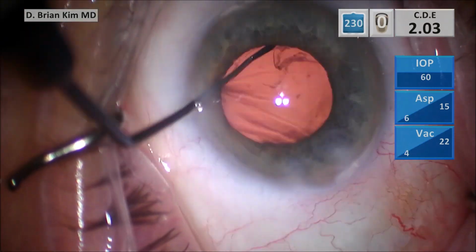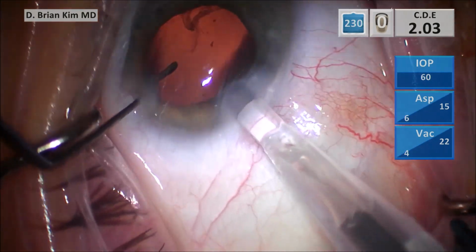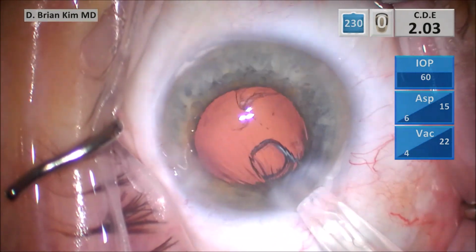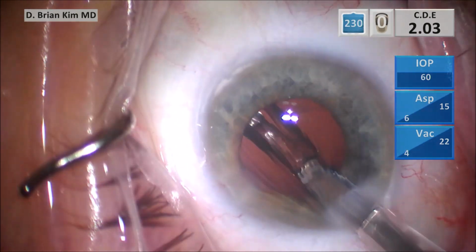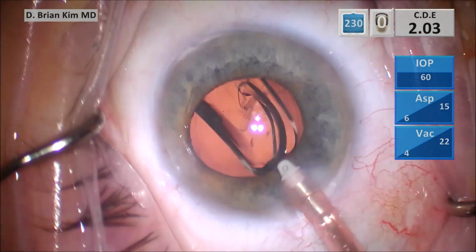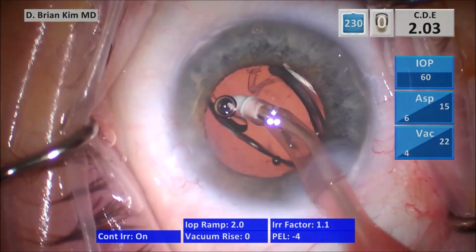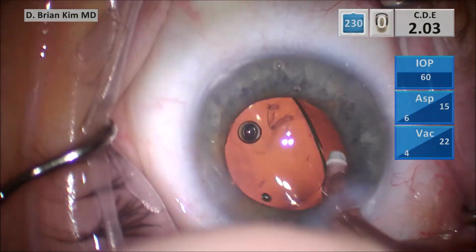And the beauty of the chopper is you can access 270 degrees of the area, except for the area that's subincisional to the chopper. And so they give you a lot of versatility in being able to go after lens pieces. And finally, you want to use the chopper as a shield as well. You can protect the pupillary edge with the chopper as a shield.